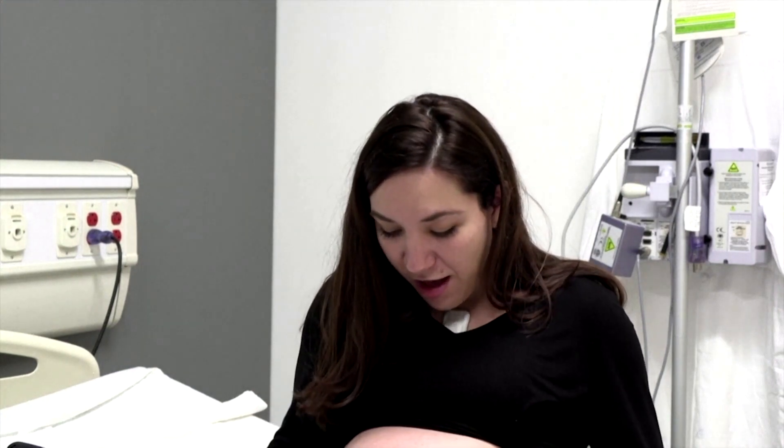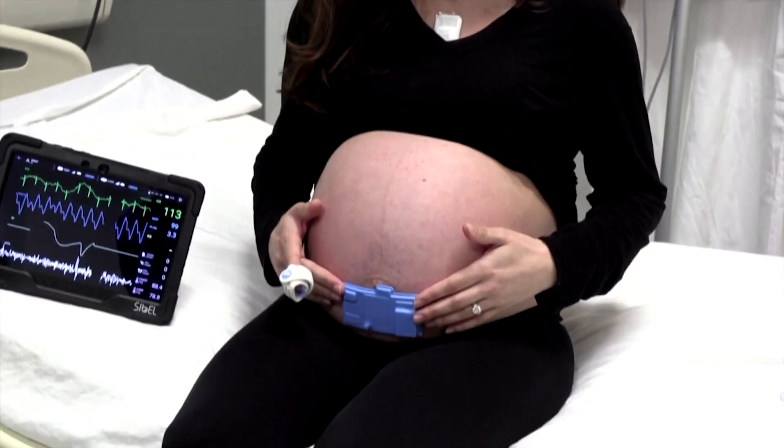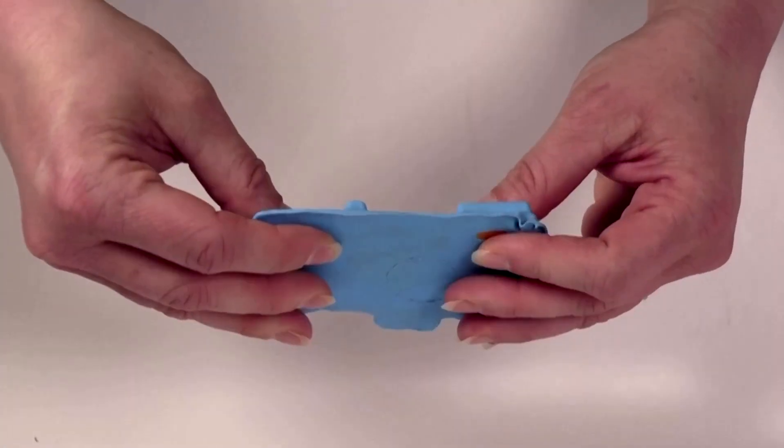Together they're time-synchronized so they can actually generate a wireless blood pressure measurement. The last sensor is the one on my belly, which is measuring uterine contractions and also fetal Doppler — the measurement of the fetal heart rate.